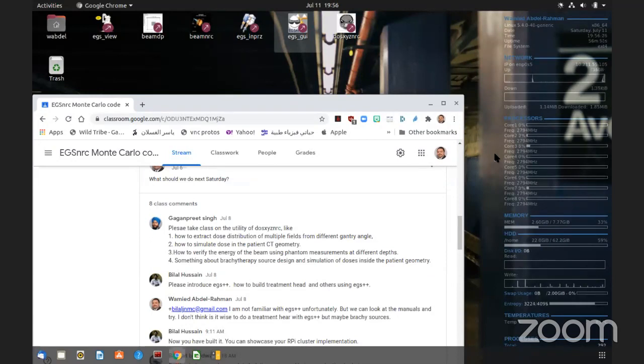But when we treat patients, we usually use isocentric treatments, so the distance to the patient surface is not going to be 100. It's going to be 70, or probably 80 or 95, depending on where the center is placed in the patient.